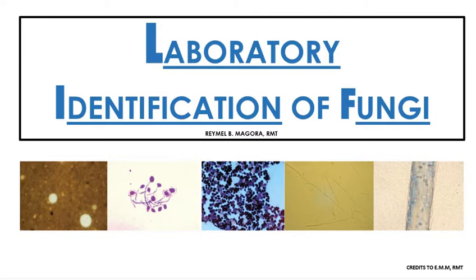Since pagpunta ninyo sa hospital on your internship, napapansin kasi natin na bakit walang mycology. Lahat ng sections, of course, you have the different sections and then walang specific section for mycology. Although alam naman natin that it is under microbiology kasi bacteriology is already also a part of microbiology. So that yung mga modern clinical laboratory, kailangan din nila mag-provide ng methods kung paano ma-isolate at ma-identify yung mga common causes ng mga iba't ibang fungal infections.